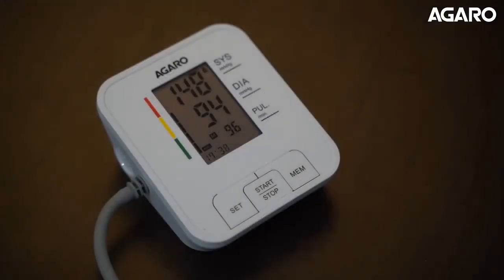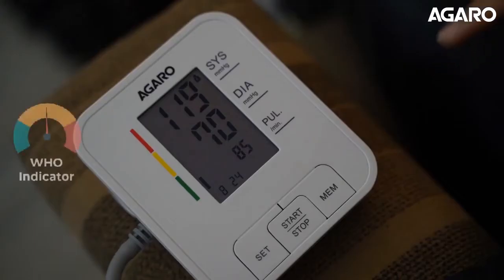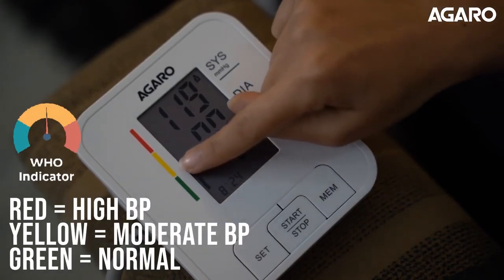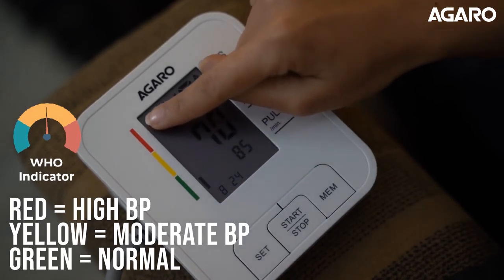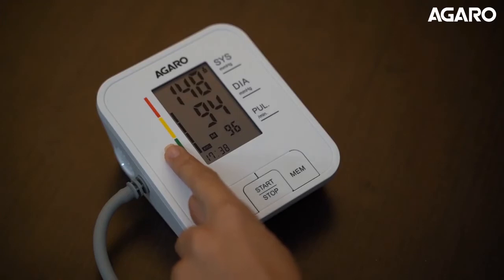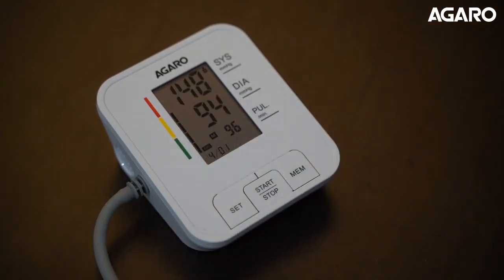The readings are also provided via English language audio playback. The WHO traffic light bar at the side helps you compare your readings with the WHO approved standards for normal, moderate, or high blood pressure. The audio playback also verbally compares your blood pressure with the WHO guidelines.